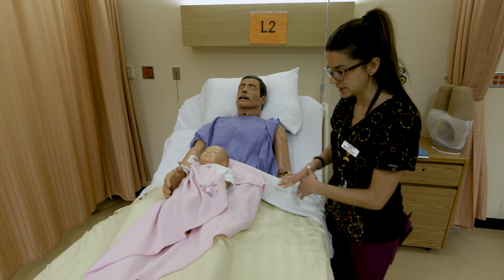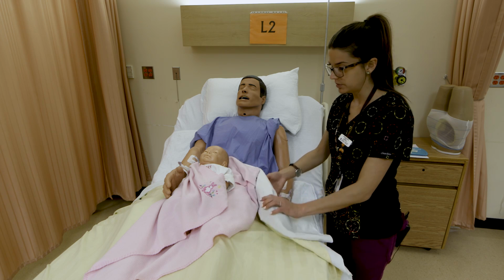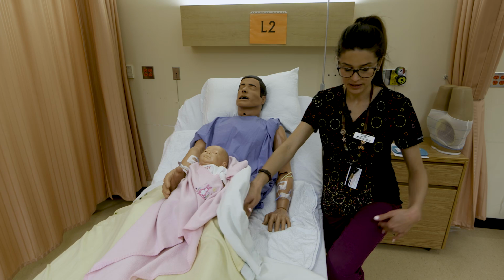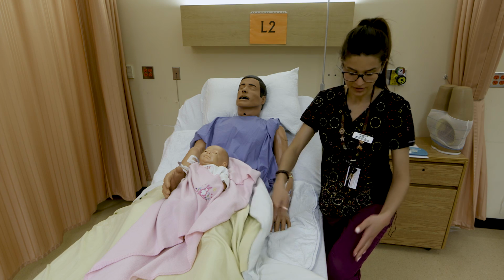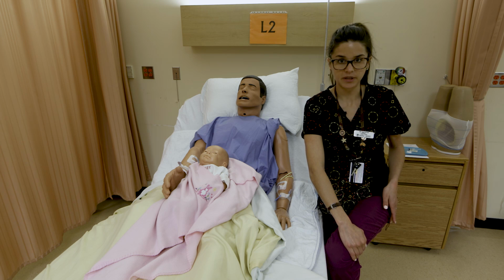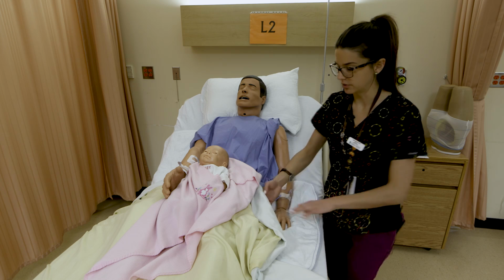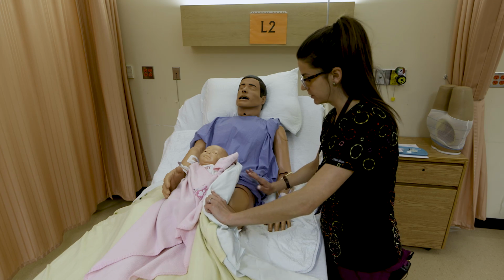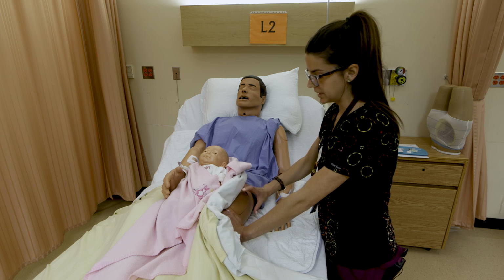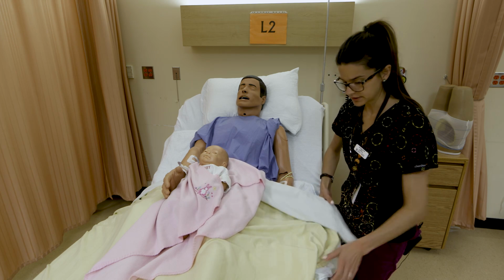Another site you can use on an adult would be the vastus lateralis. That would be along the person's leg, just lateral. You can put a hand on the top of the knee and a hand on the base of the hip, and then it's that area, the middle third in between there, that you can go with. So again, it's a bigger area. We could put a hand on the hip, hand on the knee, and we're going to go in this dense muscle area. So that's vastus lateralis on an adult.